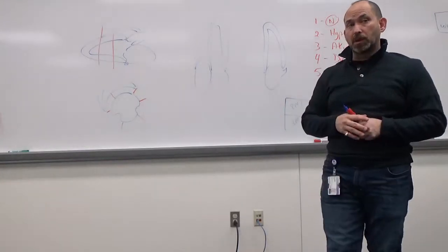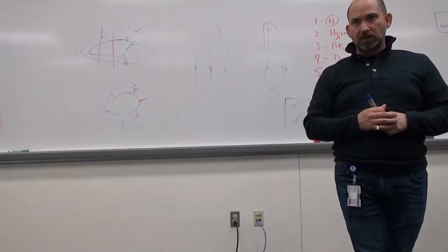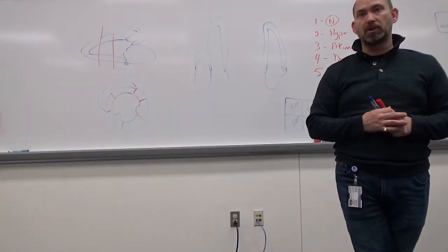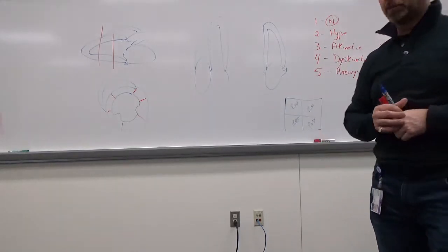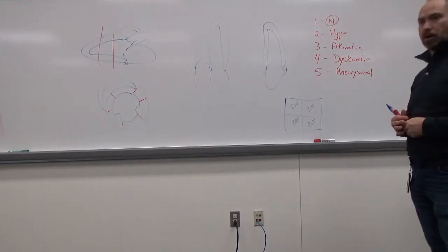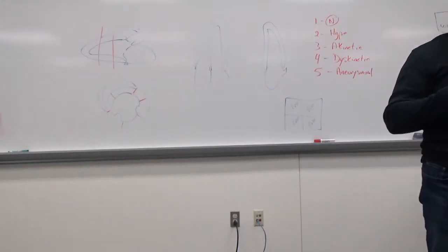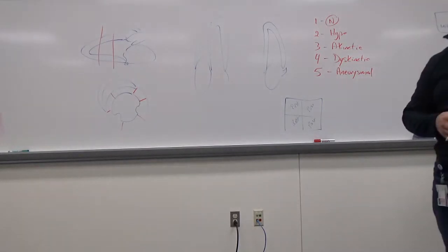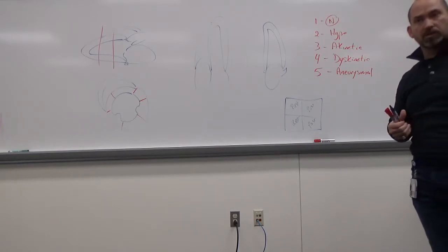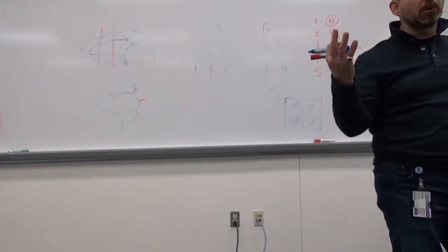What do you expect on blood pressure response? Okay, so it should be increasing. If we ever get a really big decrease in blood pressure, that's a bad sign for sure. But the patient's also going to be likely pretty symptomatic. Okay? So just think about what the normal heart reaction to exercise would be. If I do a stress and I don't see the heart change and it's just doing the same thing, would you think that's normal or abnormal? That's abnormal because we're pushing it harder. We should expect it to start squeezing harder and faster. So if we're getting a very similar look to what resting was, then we're not doing it right.